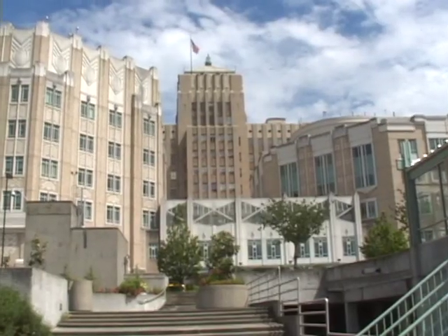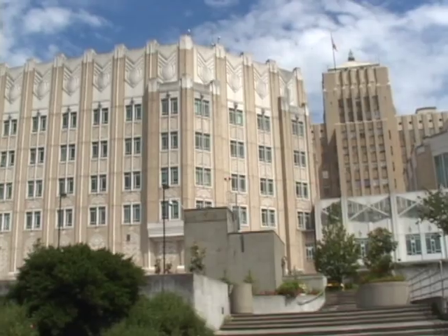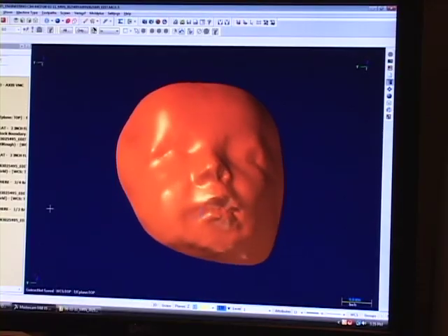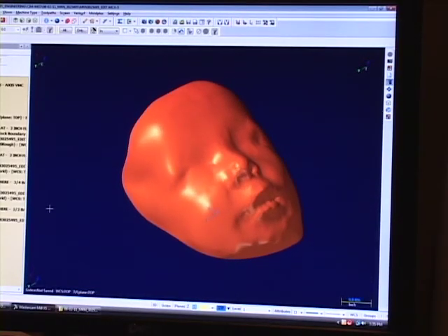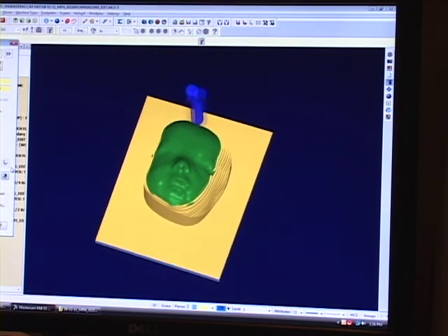My name is Robert Duffett and I'm with SimMed. We started working with Harborview creating total facial orthosis, or the face mask, by way of using a scanner and Mastercam software to edit the process.